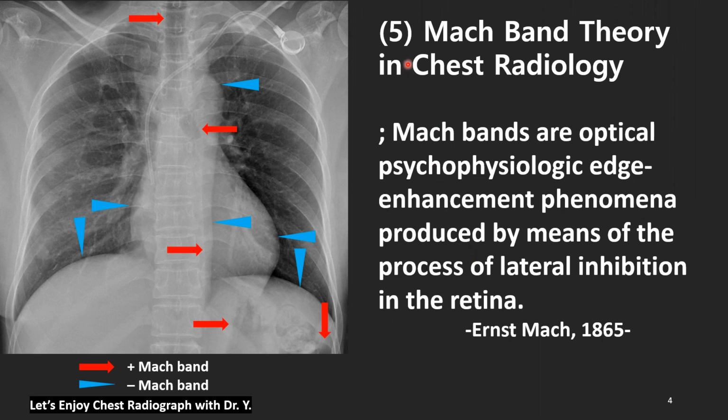Let's begin today's session. Session number 5, Mach band theory in chest radiology. Mach bands are optical psychophysiologic edge enhancement phenomena produced by the process of lateral inhibition in the retina. It was described by Ernst Mach, 1865.